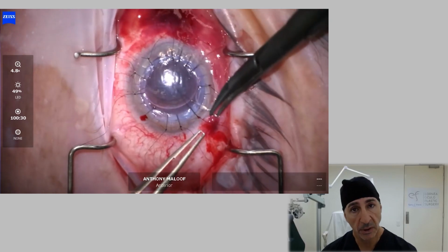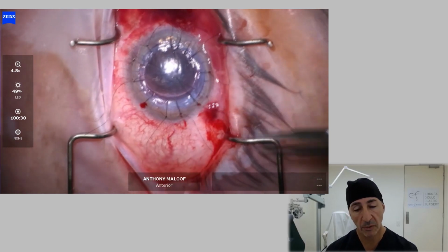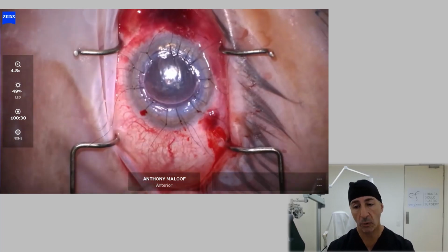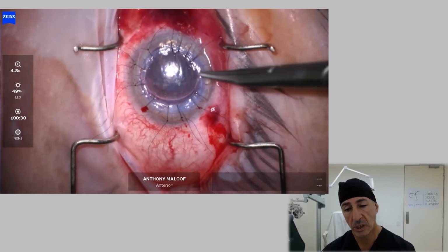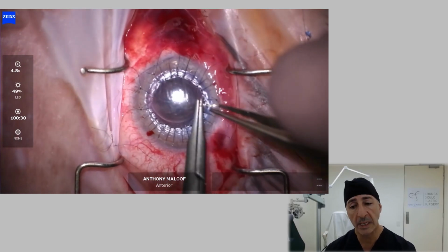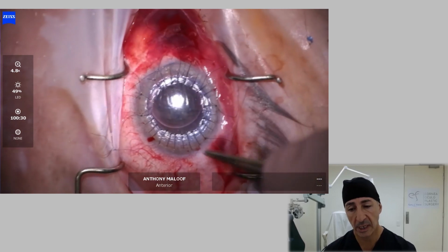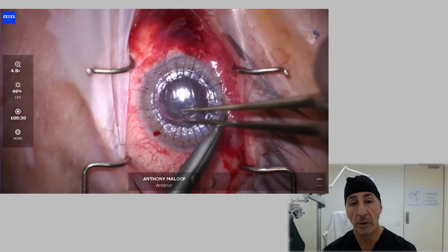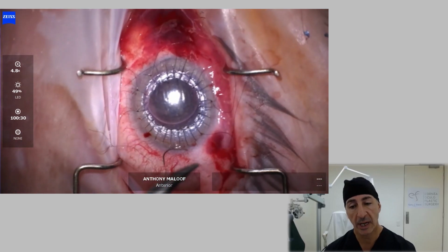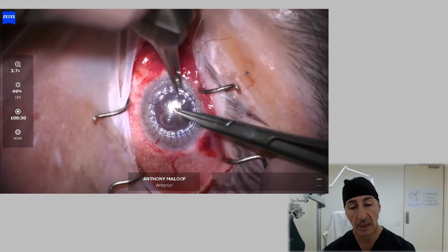Notice there's an air bubble in the chamber. That pushes the Descemet's back up against the tissue because there is a micro perforation. It doesn't stay there. I constantly swap it out with saline, back, forth, back, forth, until I'm happy that it sticks, and in this case it stuck beautifully. Look how many stitches there are. It's going in, heaps of stitches, as you can see. And they've all been replaced many times to get that shape right, because I can't predict how the host tissue is going to work. But we're getting there, and towards the end it looks really, really nice.